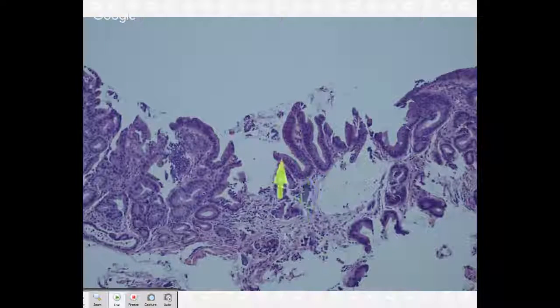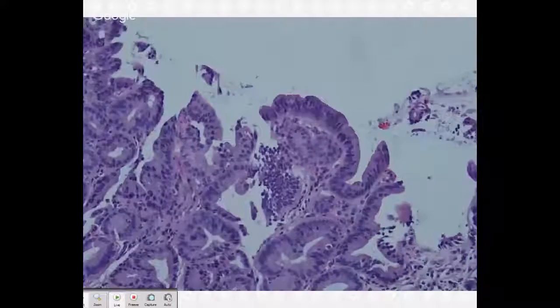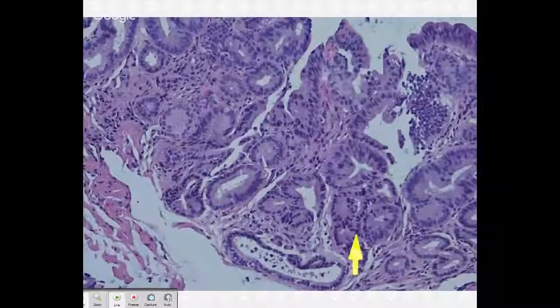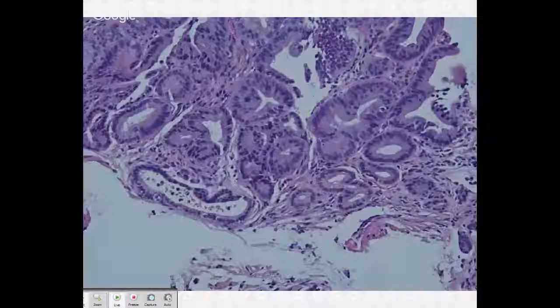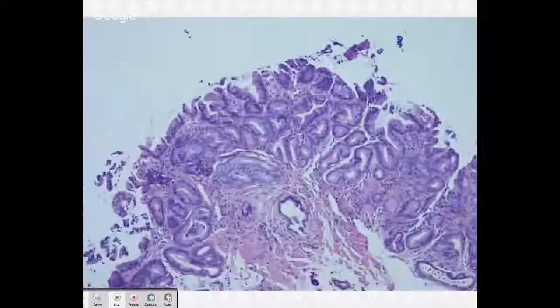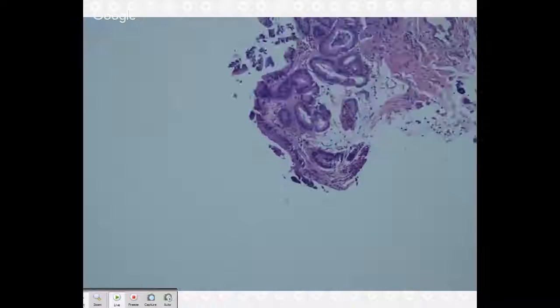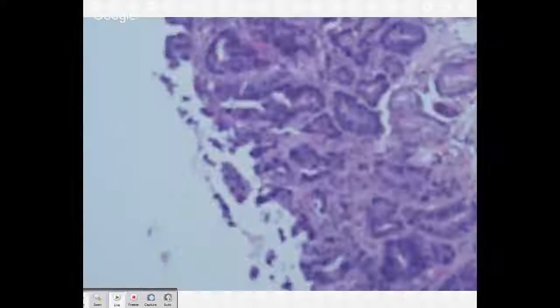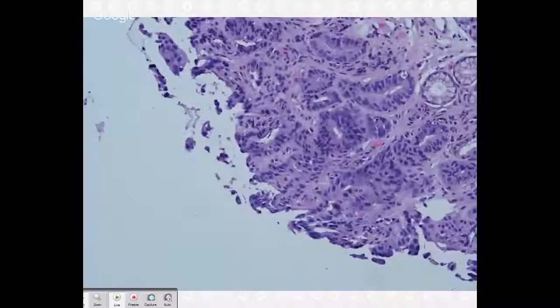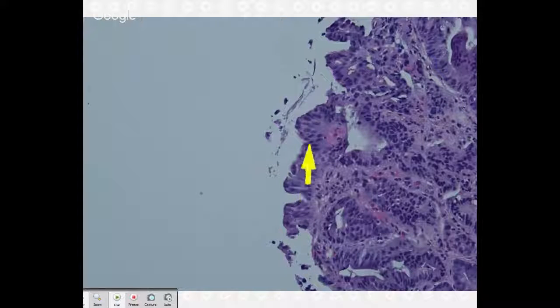What's going on there? They're piled up, like really piled up on one another. You've got about 5 nuclei where one needs to be. You have decreased amounts of cytoplasm. You have complex architecture. Again, remember, you're back-to-back glands where you don't have the lamina propria in between them. Never a good sign. Same thing over here, back-to-back glands, piled up nuclei. Same thing over here. This one just got a little mishandled probably, but at the surface, lots of mitotic figures at the surface.